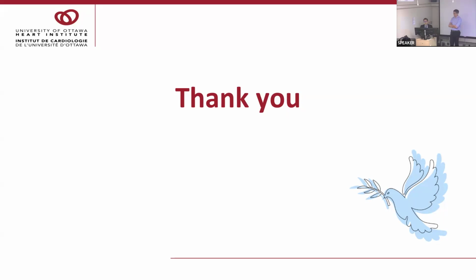Thank you so much. If we suspect coronary microvascular dysfunction rather than obstructive coronary artery disease, we would order a PET scan first because it's most validated and it's feasible in our center. So PET is mostly ordered. But as I show in my slide, the SPECT MBF, I think, can be an alternative.